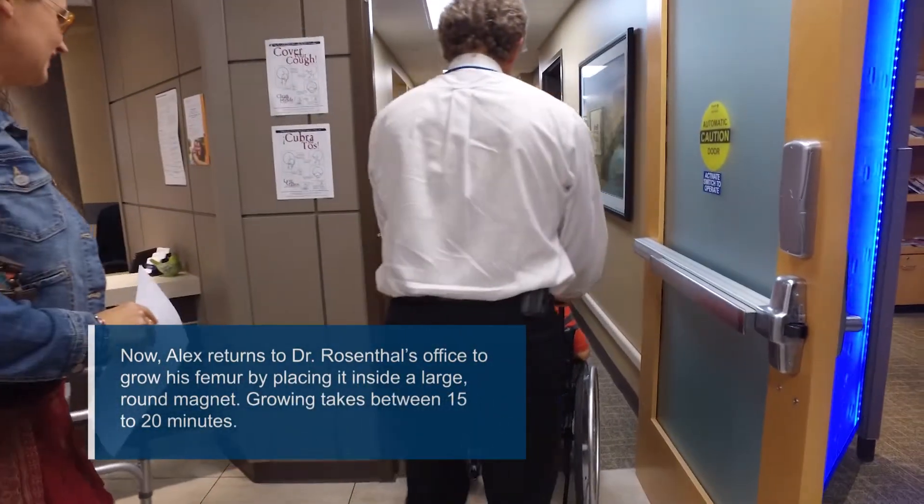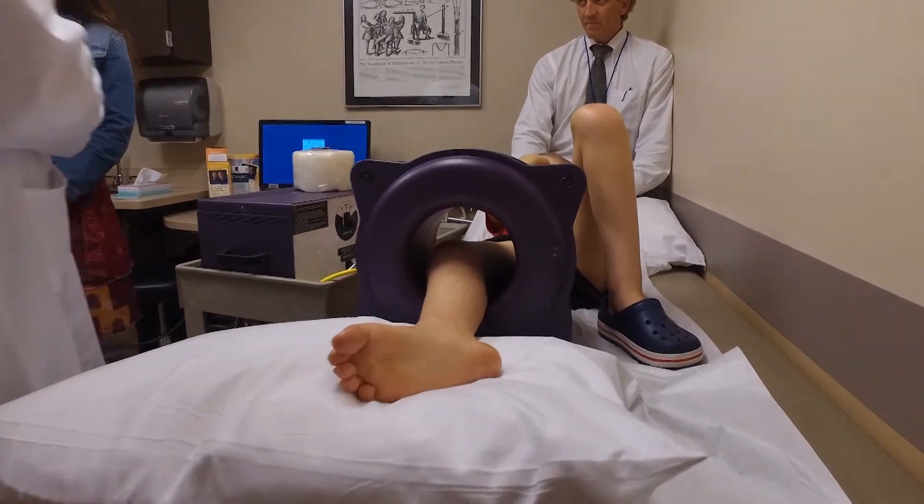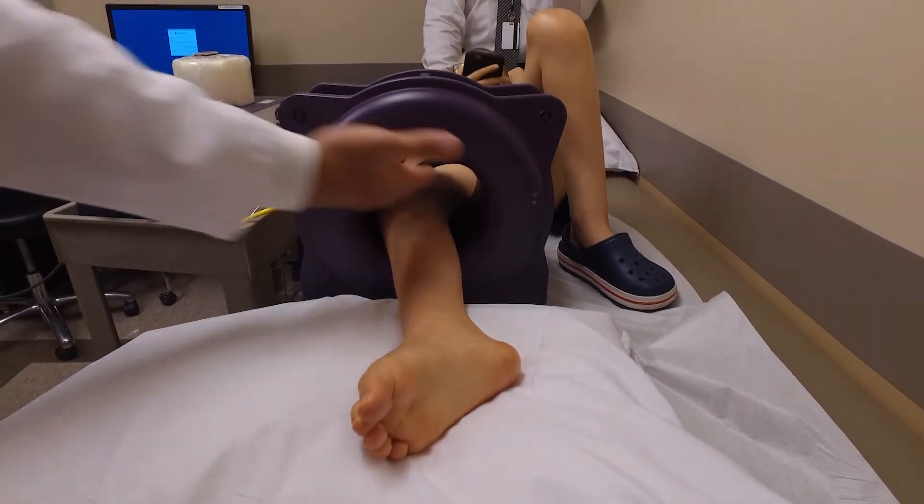I let the child turn the magnet on themselves and they can grow it. We can quantify that rate of growth based on the time the magnet is on. We can plan on growing him at four millimeters every month or two months, or eight millimeters every month or two — it just depends on his growth.